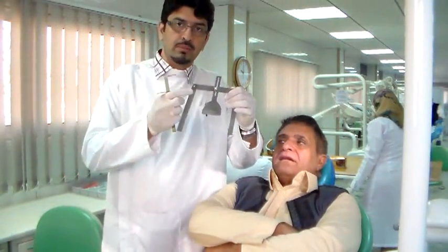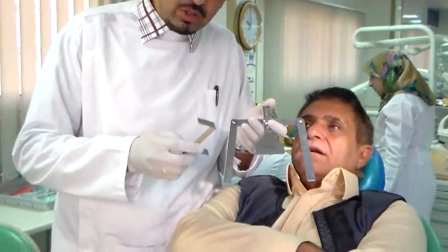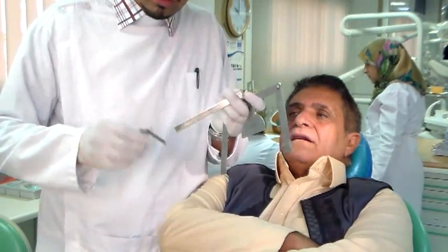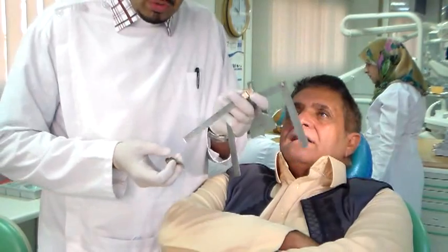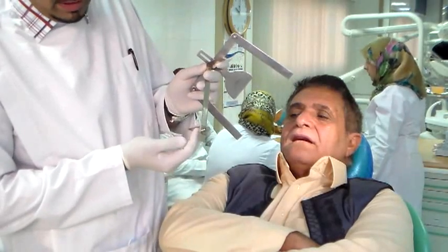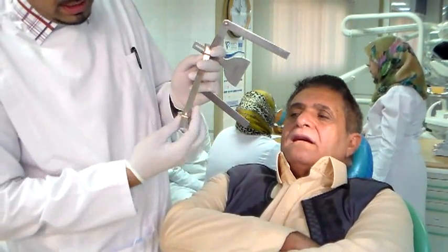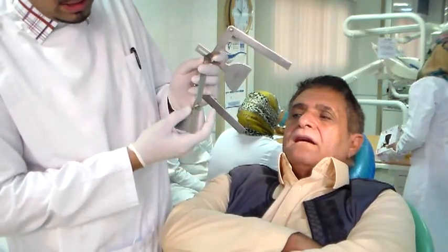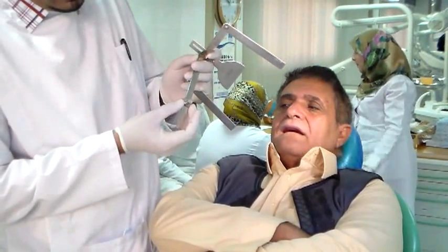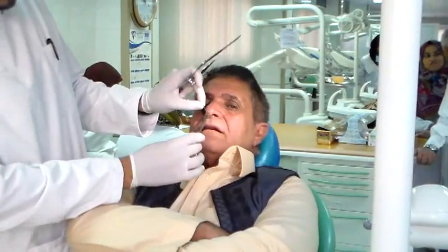I'm going to show you two instruments. This is my Fox plane, and this instrument is called the Willis gauge. The Willis gauge has got a screw end and a ruler end. You don't place it like this — you place it like this. The reason the ruler should stay on top and not down is because the readings are taken here. If you keep it the wrong way, you get a reading that is too much. To keep it within normal limits, keep it like this — one side goes on the patient's nose and chin.